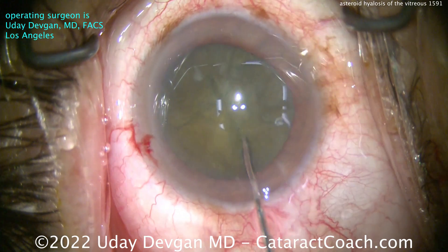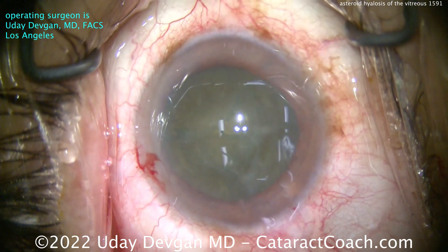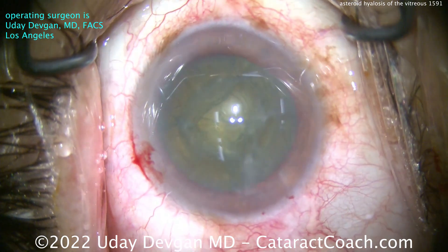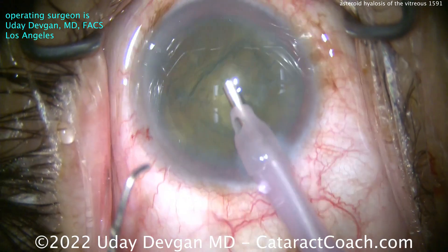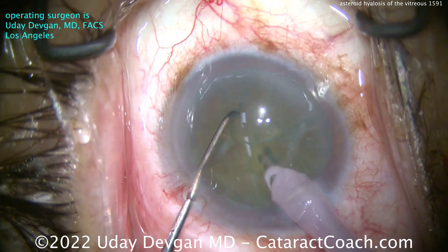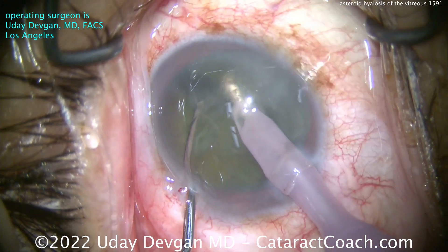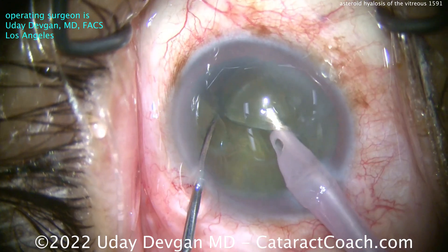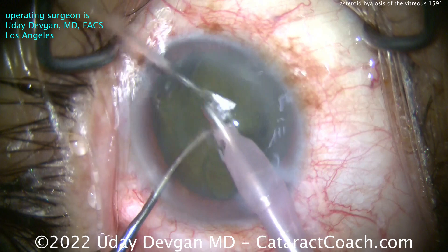The question is: can you use one of these types of lenses that splits light? I'm sure you could, but I shy away from it. In a case like this, I want to implant just a monofocal IOL. I believe that's the best choice because a monofocal lens is not going to have any other aberrations being induced. You're not sacrificing any image quality, you're not sacrificing any contrast, you're not inducing any more light splitting, there are no diffractive rings, and you're not causing glare or halos. So in this case, I'd rather just put in a monofocal lens, and that's what we're going to do.